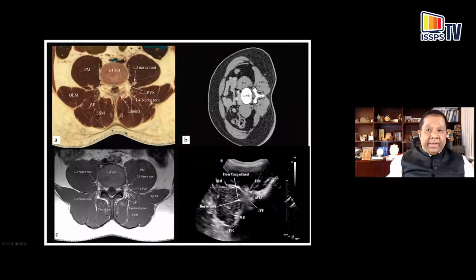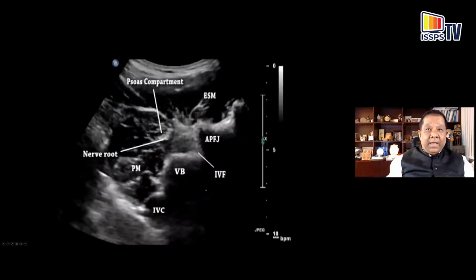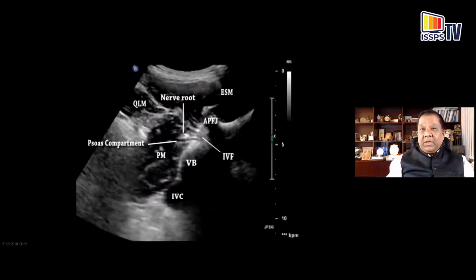So George, if you're still there, these are the intermuscular planes I was alluding to before. You can see here the erector spinae muscle, but you can see this retrolaminar area, which is also hyperechogenic, which is fat, and the intramuscular plane that makes up this plane. So you can see in another image how clearly you can visualize the lumbar plexus nerve within the posterior part of the psoas muscle.